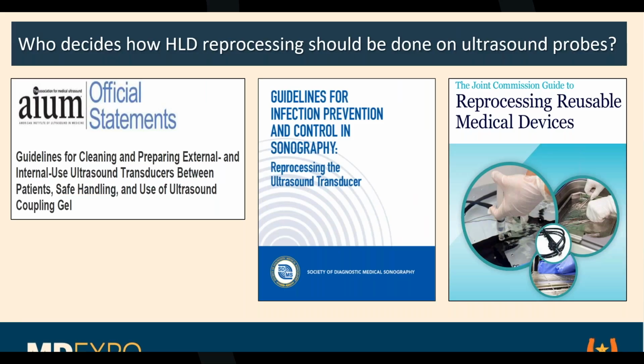Okay, so who decides how HLD reprocessing should be done on ultrasound probes? Well, again, the FDA is ultimately responsible for developing guidelines that the OEMs have to follow, and they can't deviate from those. So if a hospital asks, can you recommend a different way of doing this? The answer is no, because that would be against the FDA guidelines for which that OEM has received their 510(k) to sell the product.